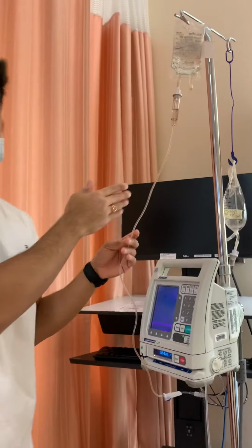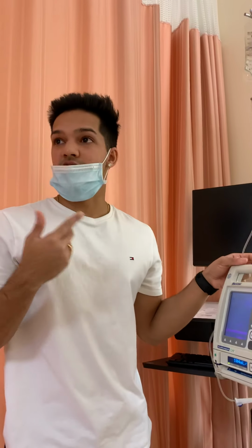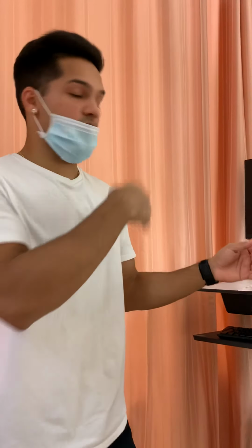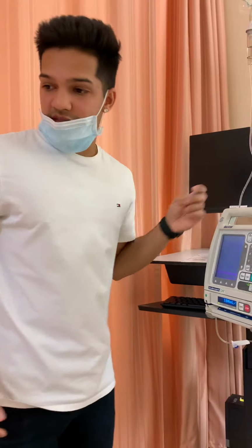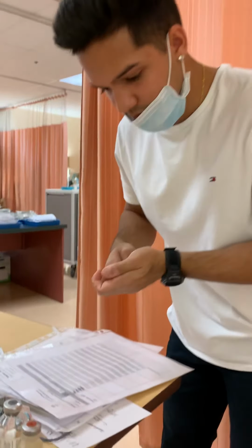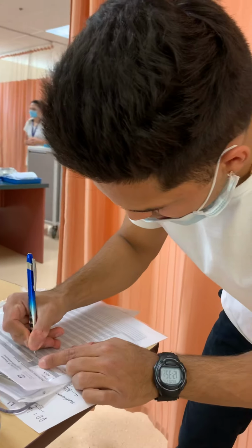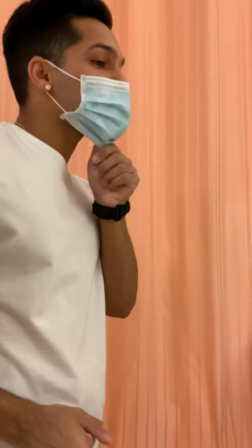And I'm also going to be labeling my secondary line, so the nurse knows when I put this up, with my name, initials, and date, so once you can change it. And once I've done that, I'm just going to be signing the MAR. 0600, MK, UMSN3. And after I leave the room, I'll also be signing the fluid balance sheet. And now I've signed the MAR.